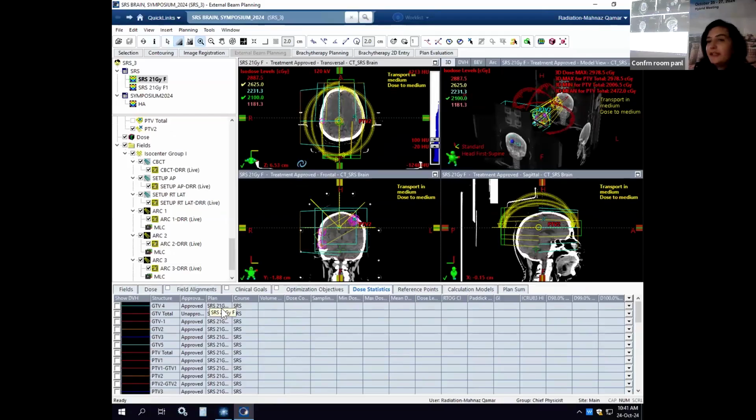It makes our life very easy because, with a busy center such as ours, we don't have to play with the accurate angles. I've actually worked with Brain Lab before, and it took a while to come up with the good angles, but obviously once you're used to it, you can do that easily. But in our case, we know that we have these set of angles and we can just choose between those. And as of now, we haven't had any issues.